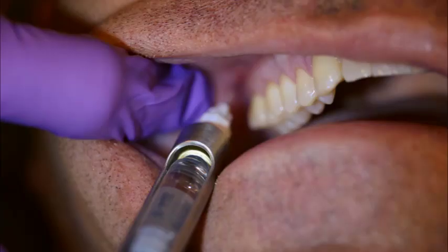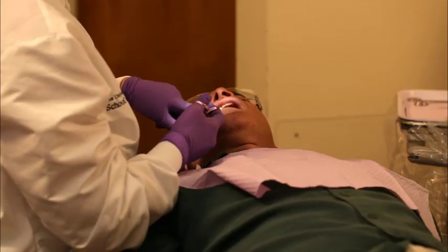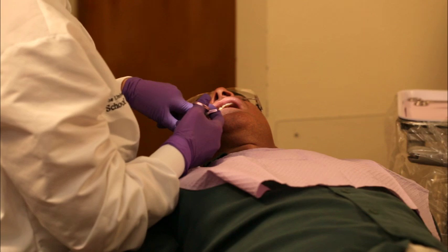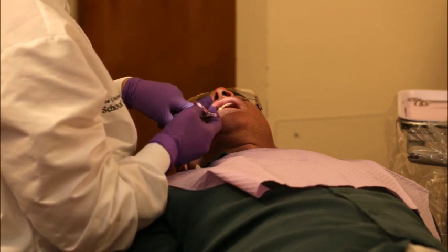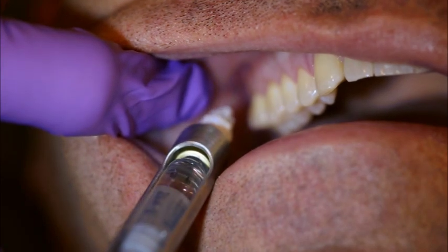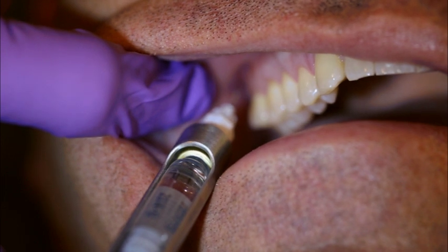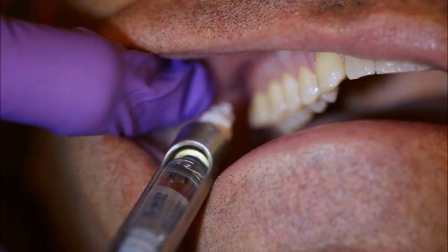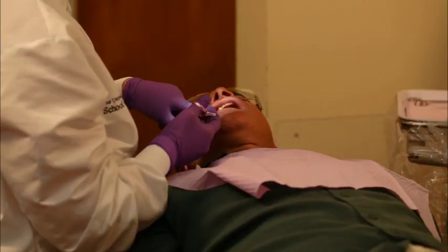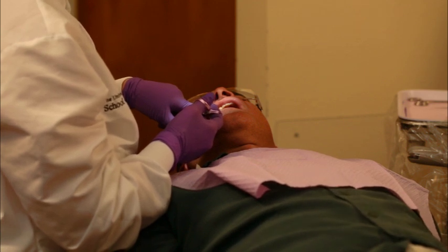First, aspirate as usual at the depth of penetration. If aspiration is negative, rotate the syringe barrel gently toward the operator and re-aspirate. If aspiration is negative, rotate the syringe barrel gently back to the original position and aspirate again. If a negative aspiration is achieved after each of the 3 aspirations, slowly deposit approximately 0.9 to 1.8 milliliters of solution, 1/2 to 1 cartridge, over approximately 60 to 120 seconds, and aspirate in the same plane after each 1/4 of the cartridge is administered.